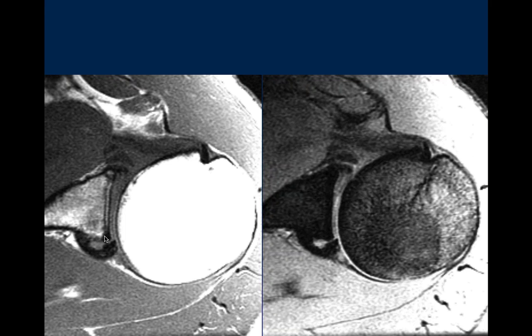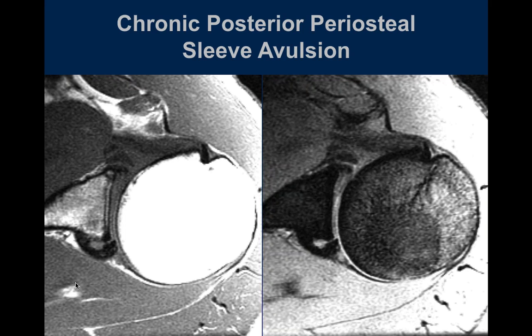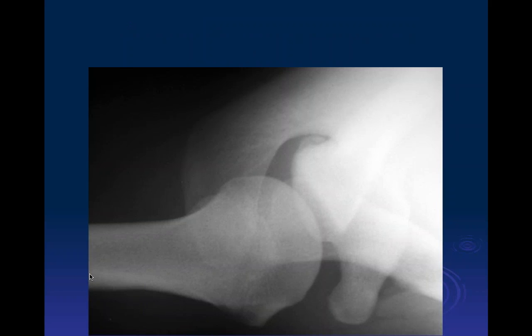So this is the posterior labrum. That's a tear in the posterior labrum. This is the periosteal attachment. Wow, that looks really dark and thick, like a ligament. What we saw in some of those lesions in the anterior, and this is another POLPSA lesion. But again, basically, it's calcified. Well, I don't know if it's calcified. Sometimes it can calcify, and then it's called a Bennett lesion. I'm not sure whether this one's calcified or not. But this is just that capsular thickening, and we saw it develop fairly rapidly in 6 weeks, like that anterior Perthes lesion that we saw in the anterior, and this is just a posterior one. That's scar tissue.